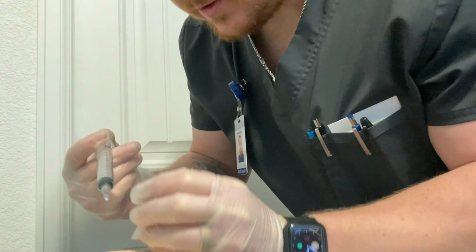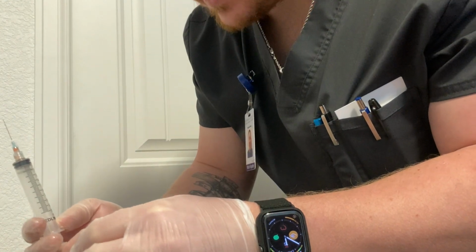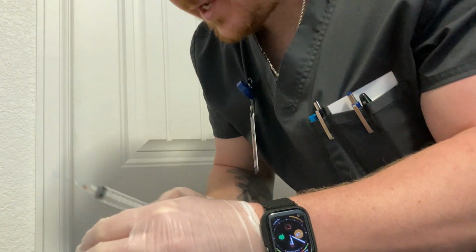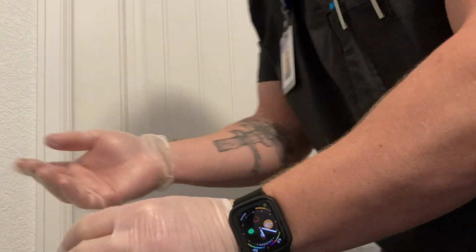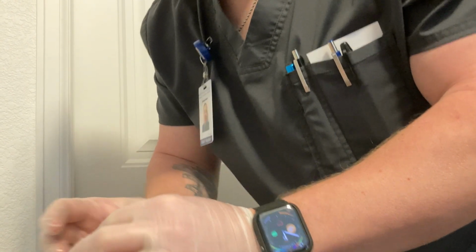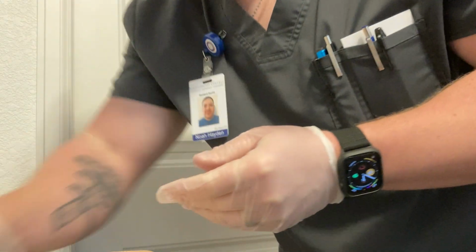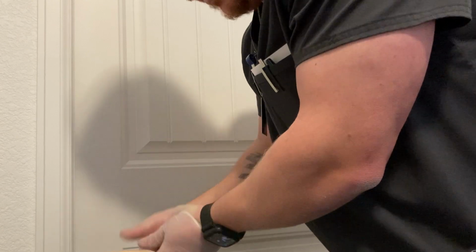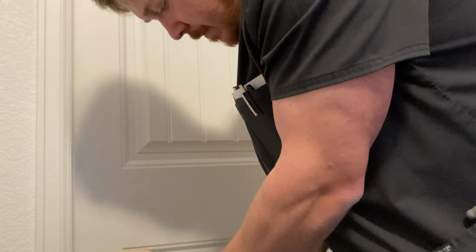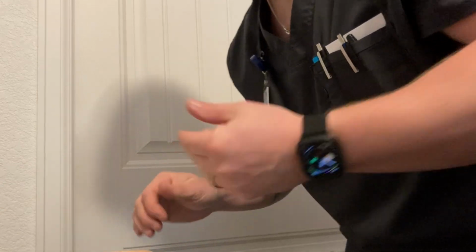Once I'm done, I will quickly remove the needle and hold pressure. Do not rub, especially since this is heparin, as that will cause more bleeding. I will not recap my needle, but I will dispose of it in a sharps container. And when I am finished, I'll make sure there's no bleeding. If there is any slight bleeding present, I will apply a Band-Aid. I will remove my gloves. I'll perform hand hygiene. And then I will document my procedure.